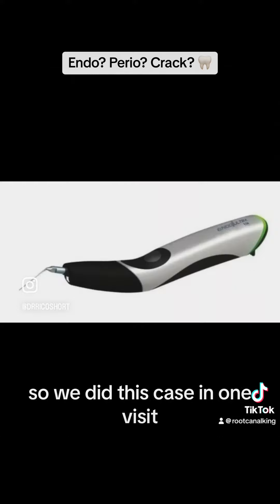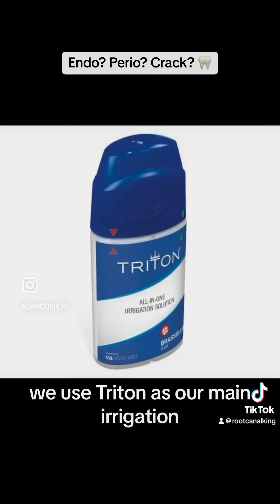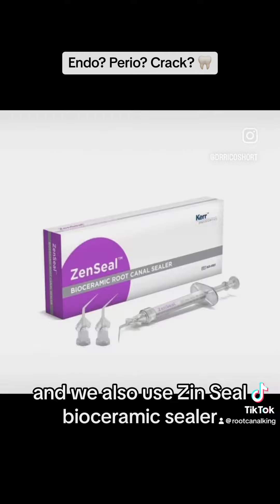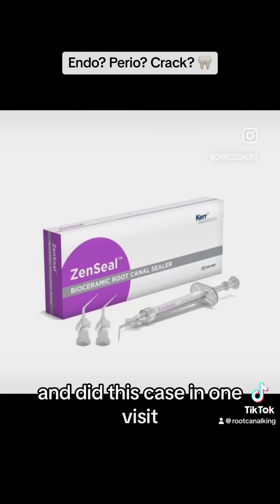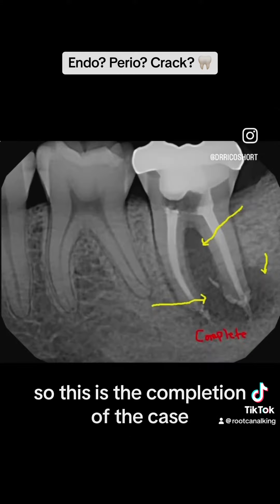We did this case in one visit. We used Endo Ultra by Vista, Triton as our main irrigation solution by Brassler, and Zen Seal Bioceramic Sealer.